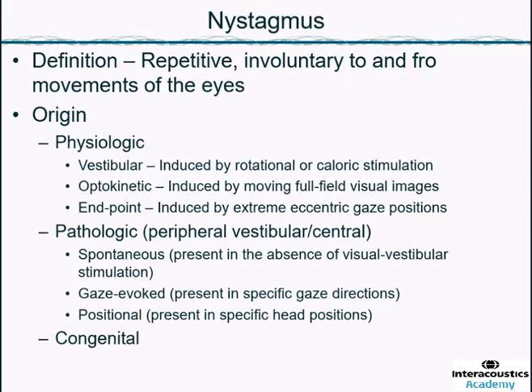which you see in normal people, especially in older people, just because the muscle tones are affected by age, the same way that any other muscle is affected. So you see endpoint nystagmus more commonly in the older individuals. The only clinical precaution here is that we should not mistake endpoint nystagmus with gaze nystagmus, which is abnormal.